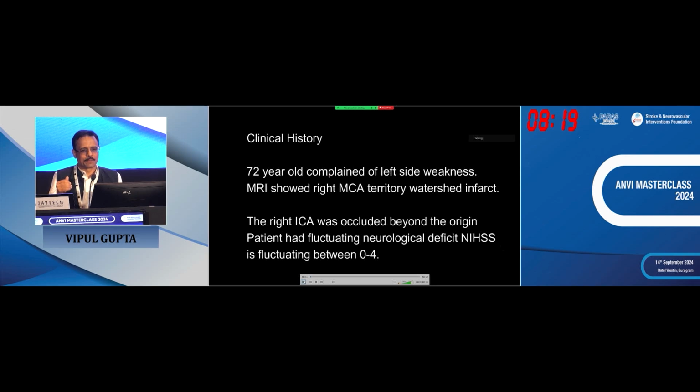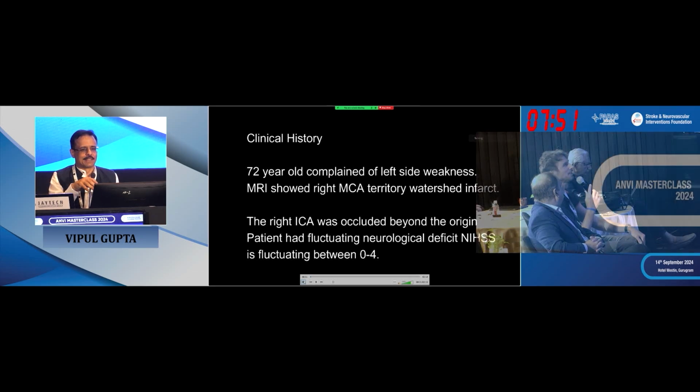So, again, you are saying we can just drop a stent. We cannot just drop a stent. I think the maneuver he did with the Penumbra to the skull base has propagated the dissection to the skull base. It's like 4 stents. And believe me, I'm doing carotid reconstruction a lot. Here you cannot sort it with just 1 stent. You need 4 stents. With 4 stents, just aspirin? What do you do? No, here you have to load with drugs. You have to be very aggressive afterwards on antiplatelet therapy.